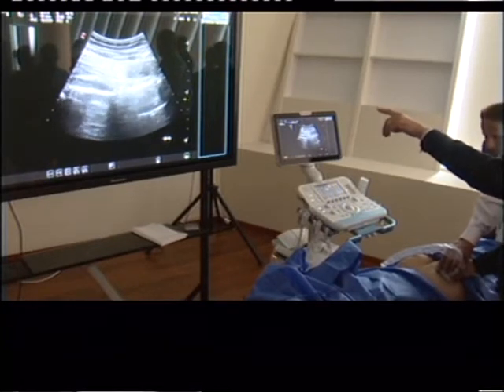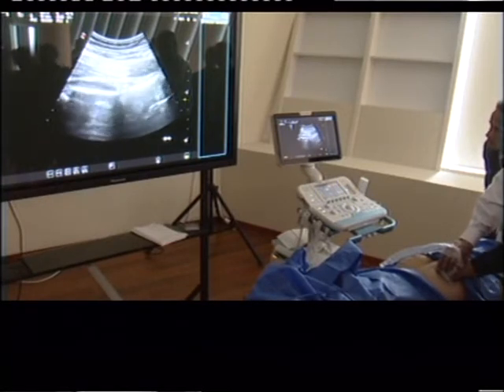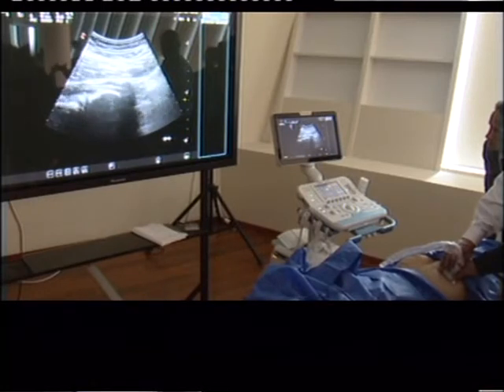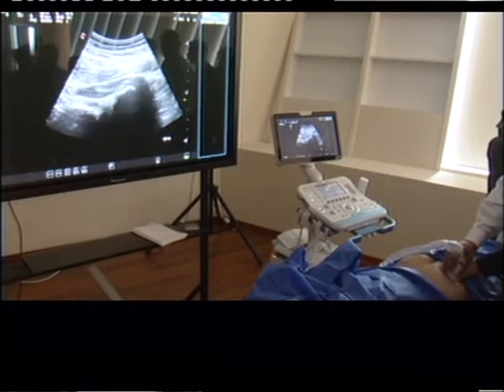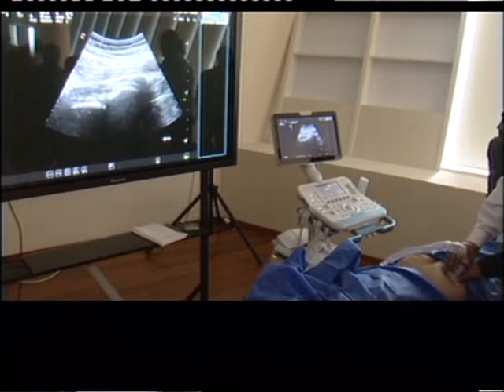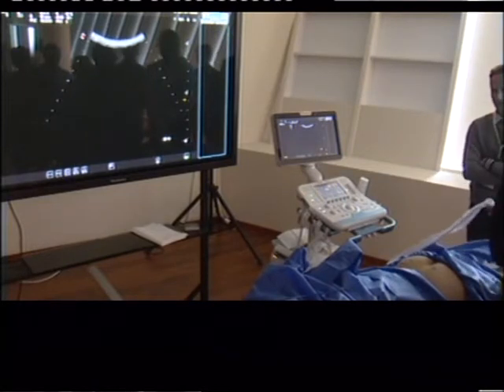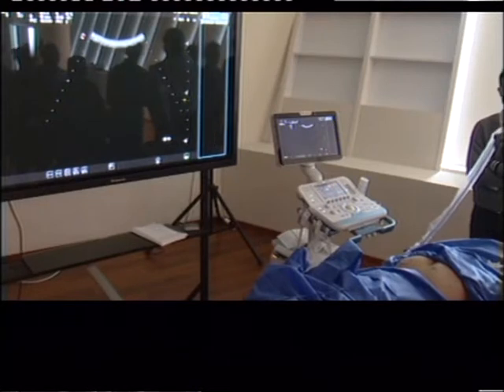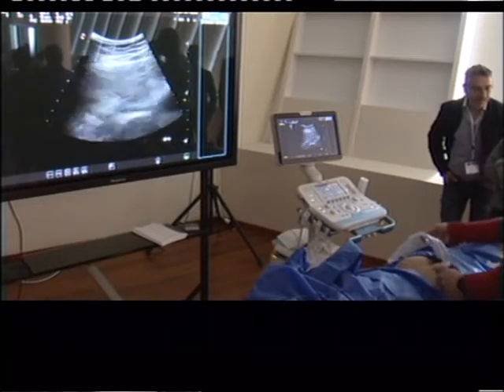Both, I told you, with the Doppler. And you go down to the bone, then you aspirate, and then you inject. Then obturator internus, sciatic nerve, and hamstring, conjoint tendon, quadratus femoris. Let's try, and then you will do it. You will do it many times in the future. It's not too difficult. You've got to try.